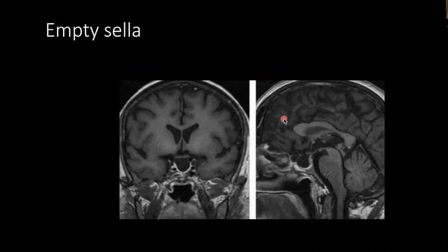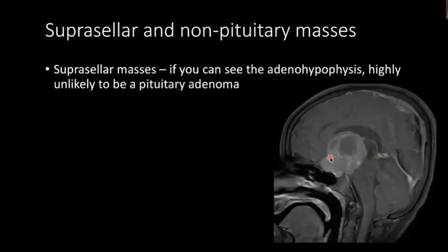Moving from mass lesions toward empty sella syndrome: the sella is enlarged but there is virtually no visible pituitary parenchyma. Now coming to suprasellar non-pituitary masses.